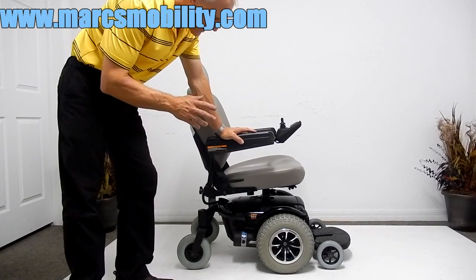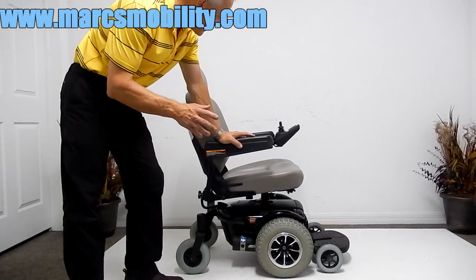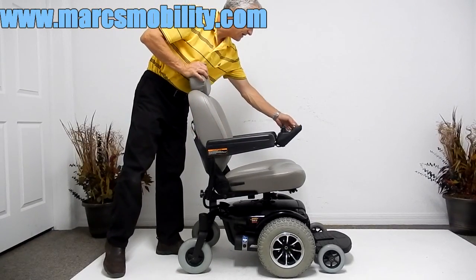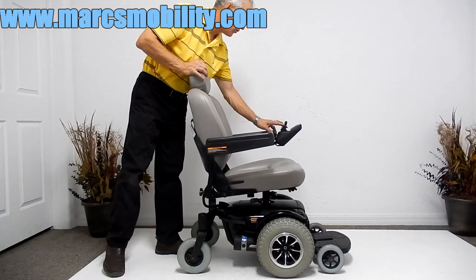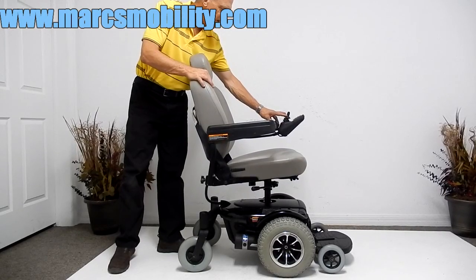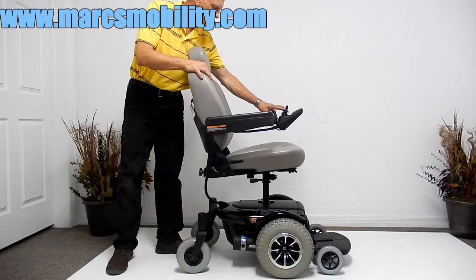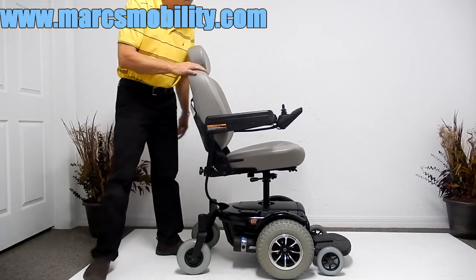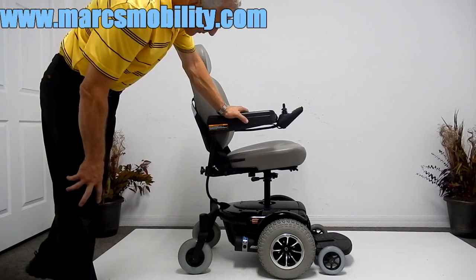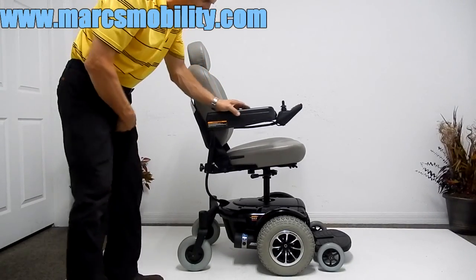The 1143 has several good benefits. The first is it has an electric seat lift. If you hit the button on the joystick for the seat lift and push the joystick forward, you will have a five to six-inch seat lift going up. The elevation is nice because if you need to reach counters or do something, you have a nice seat lift on this chair.